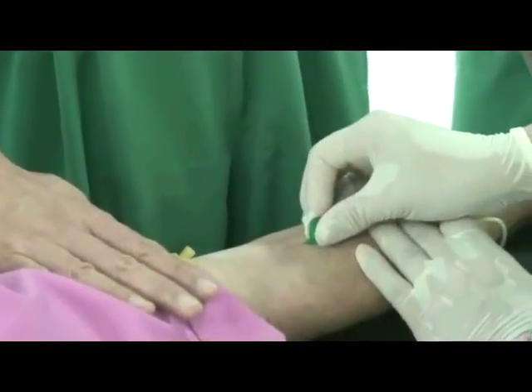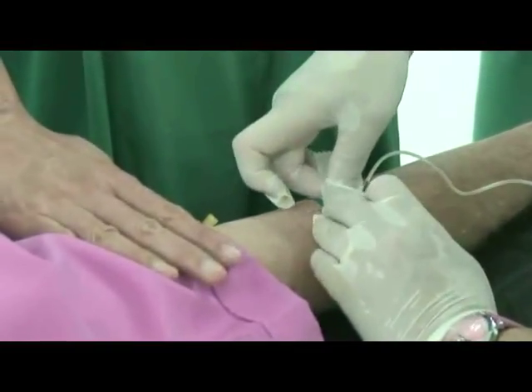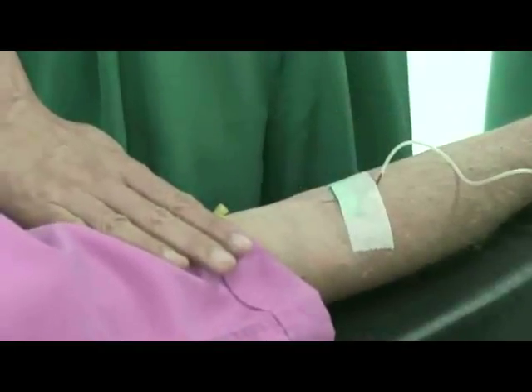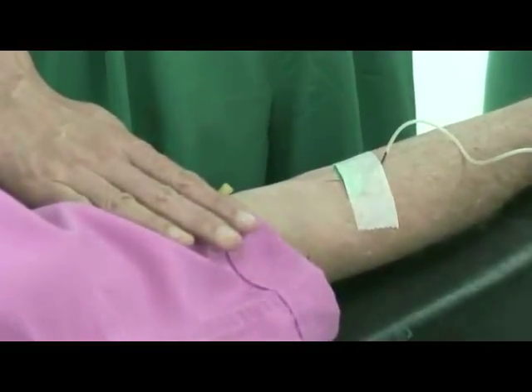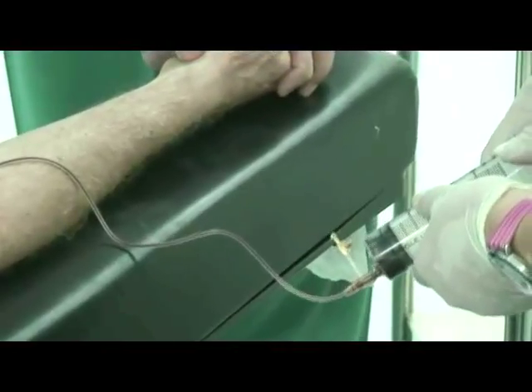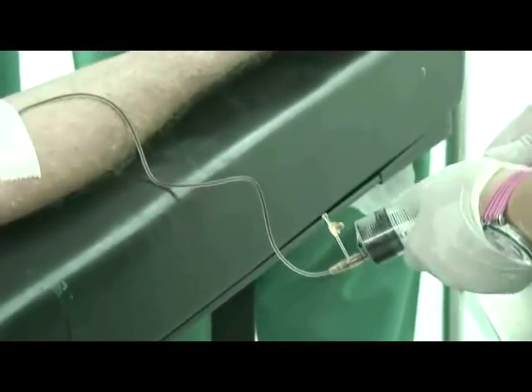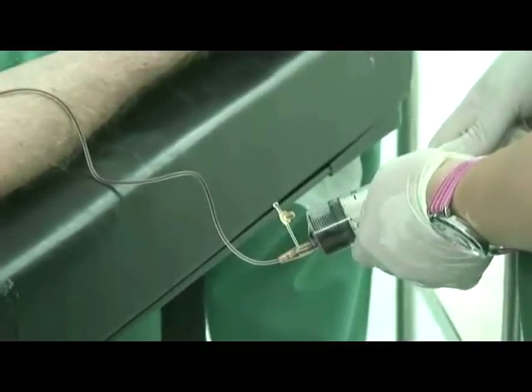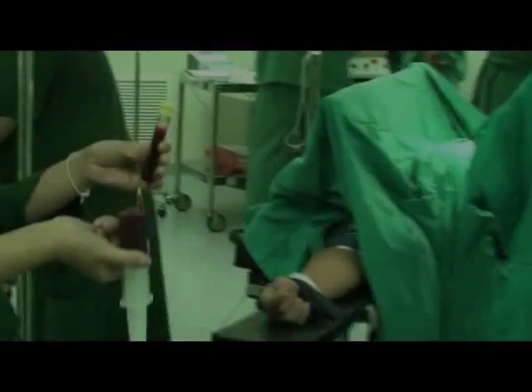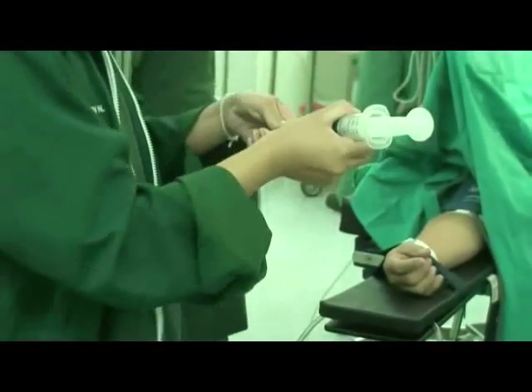To begin the PRP procedure, draw 50 cc of blood from the patient into a syringe. Inject the blood from the syringe into 6 blood collection tubes provided in the ADDI-STEM PRP kit.